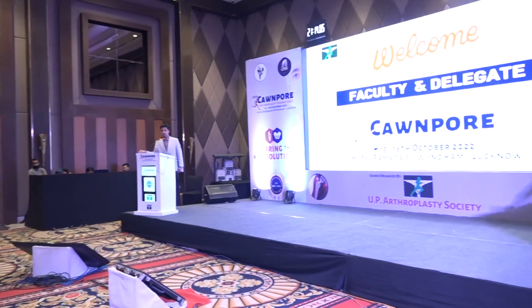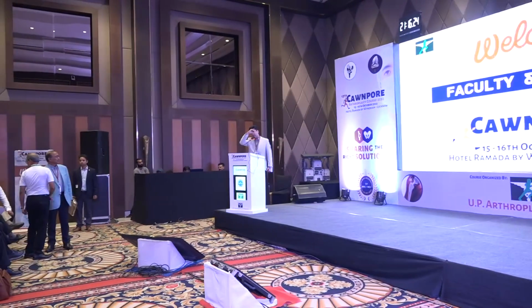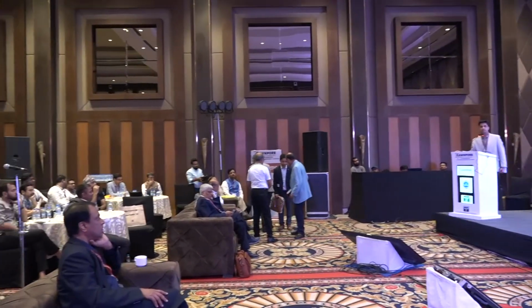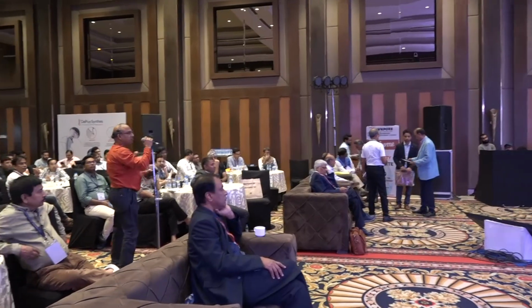Sir, for me, the workhorse is the extended trochanteric osteotomy. Wherever I have a doubt, especially in these cases that you're talking about, I don't mind going straight away to the extended trochanteric osteotomy, unless I can do a cement in cement revision.